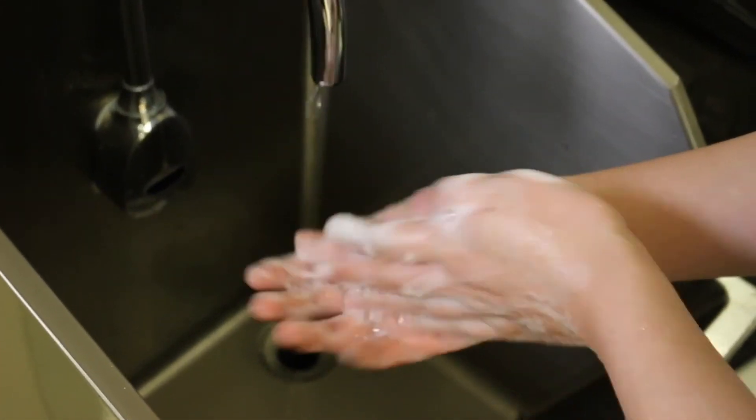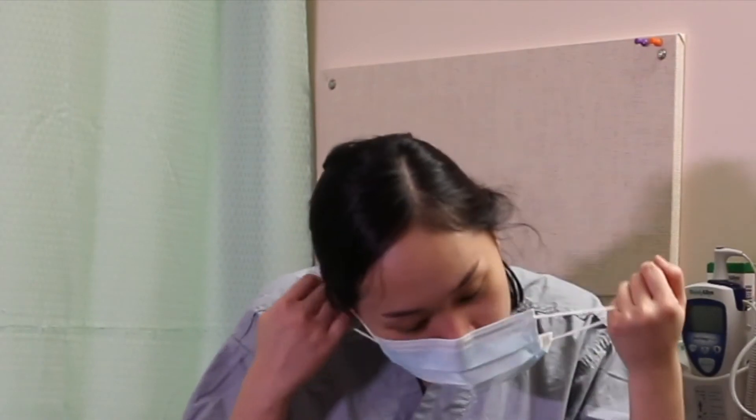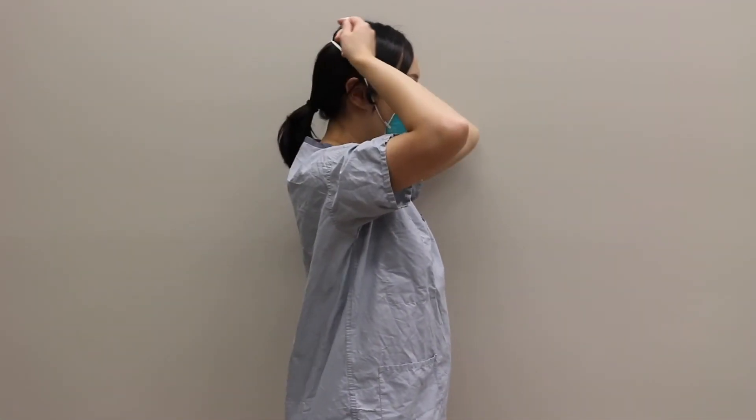Do hand hygiene. Remove the mask or an N95 respirator next. In case of airborne precautions, exit the room to remove eye protection before removing the N95 respirator.